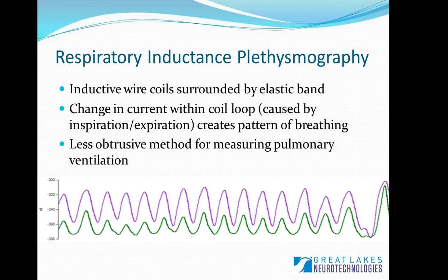So in order to measure changes in respiration, that flex sensor needs to be activated. Whereas with a RIP band, because that coil does go all the way through the band, you can measure respiration through changes in expansion and contraction really from anywhere on around the body. So if somebody is laying down or even on their stomach, you'll still get a really nice accurate respiratory measurement.